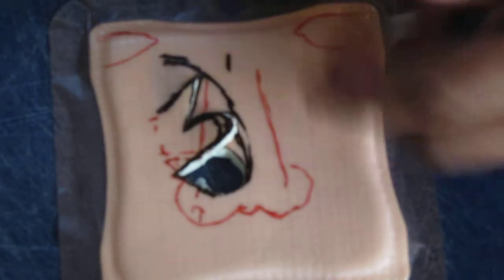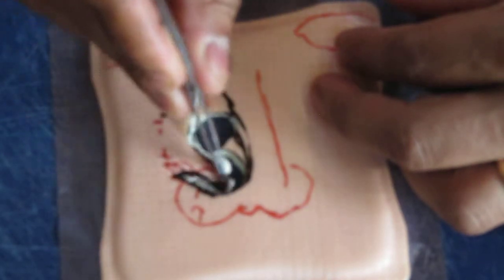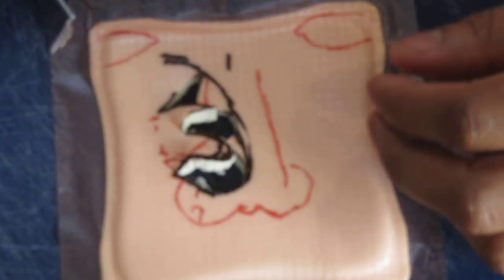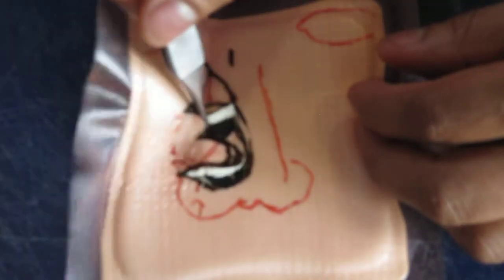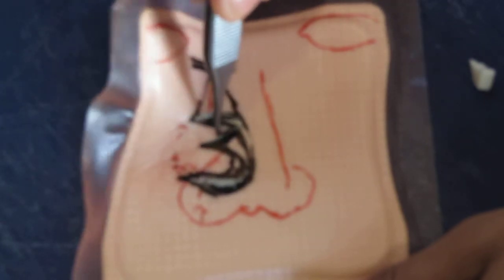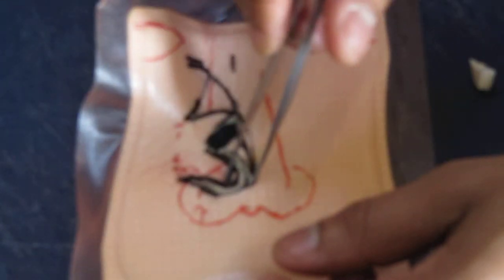And here's the dog ear taken away. This is simply going to fit into there like that, and this is going to fit into there like that, and with undermining, you see it's going to close side to side here. That's going to fit in there nicely, and that's going to fit in there nicely. So can you see that flap movement? And remember, this is slightly smaller than the defect, and this is slightly smaller than the secondary defect, and this is closed side to side really very easily.